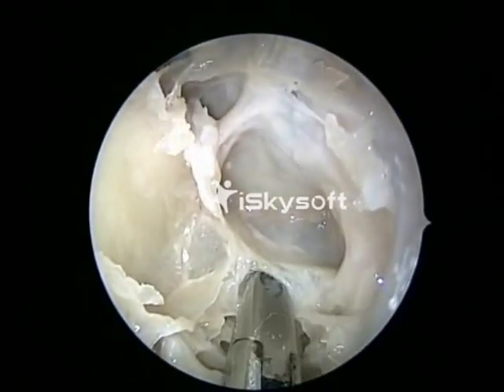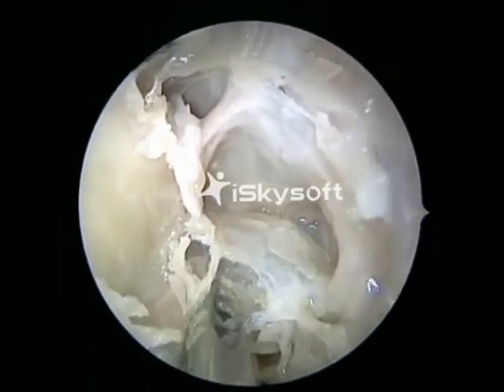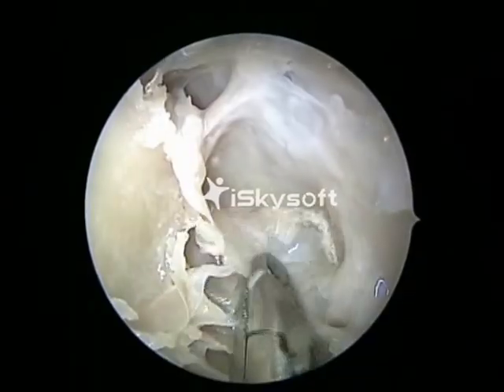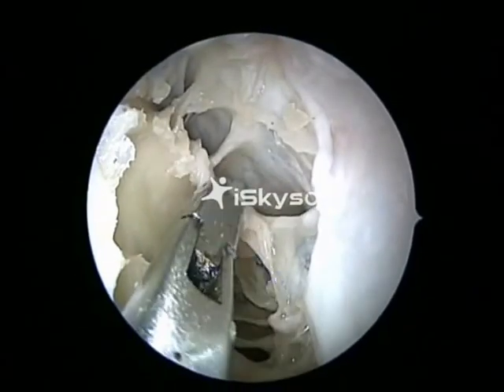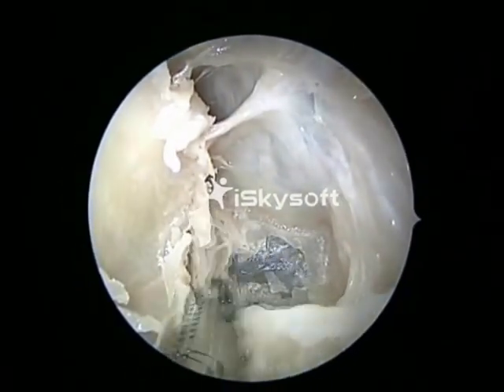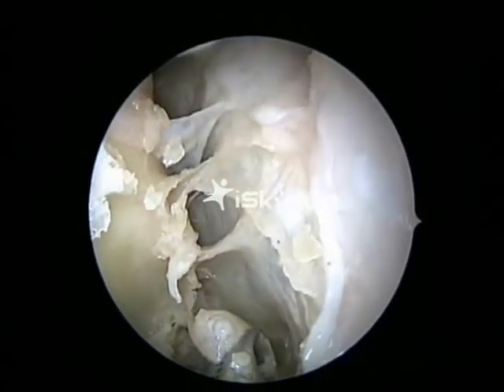We are now entering that cell. The posterior ethmoid cells are more rectangular and larger than the anterior ethmoid cells. That is the posterior most ethmoid cell being entered.